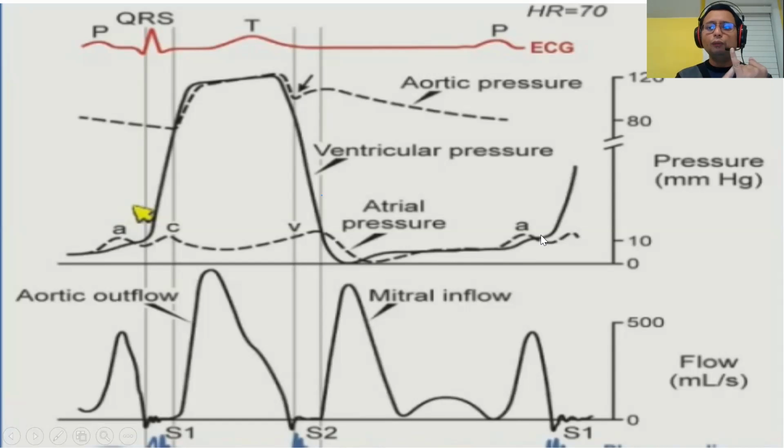So we talk about normal diastolic function, we talk about impaired relaxation. What about someone with grade 2 diastolic dysfunction and restrictive diastolic dysfunction? Both of them hemodynamically are about the same. So what happens is your left ventricle becomes stiff. Now, as it becomes stiffer, the rate of it coming down actually becomes faster. The reason it becomes faster, not because it's relaxed very well, it's simply because it becomes so stiff.